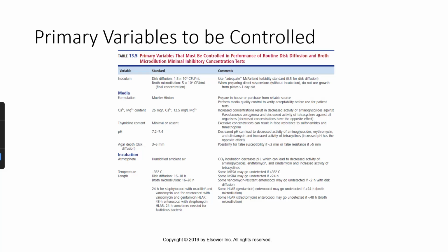These details will be on your qualifying exam. They will ask you about agar thickness and incubation temperature, time, and all those types of details. So make sure that you review this before taking your qualifying exam.